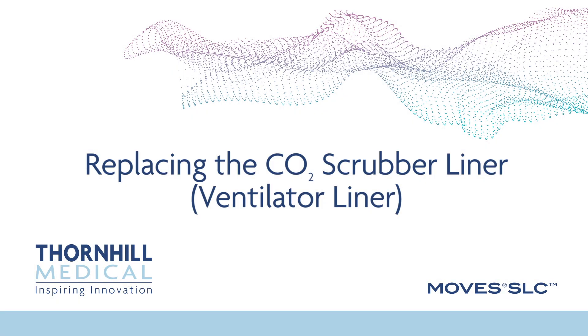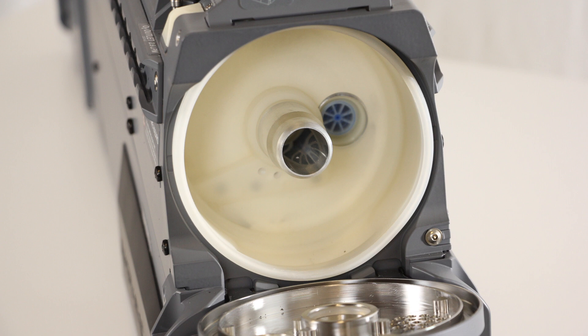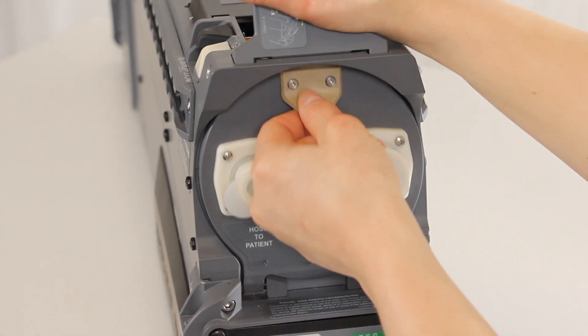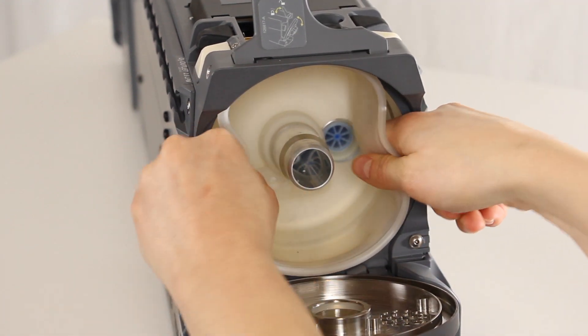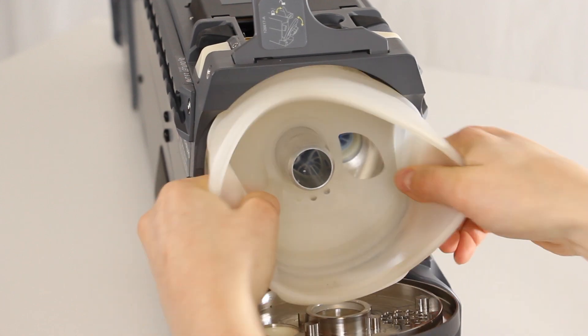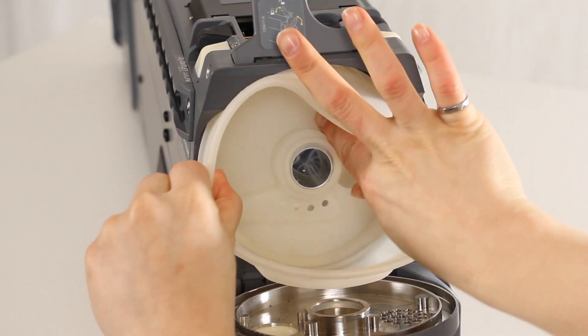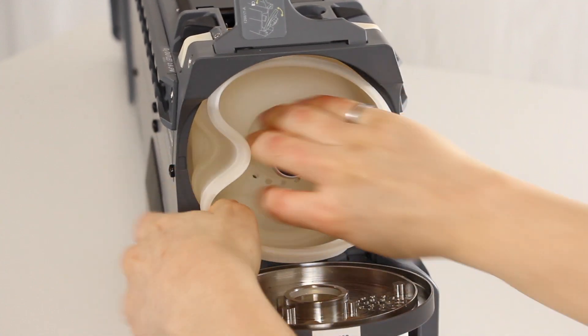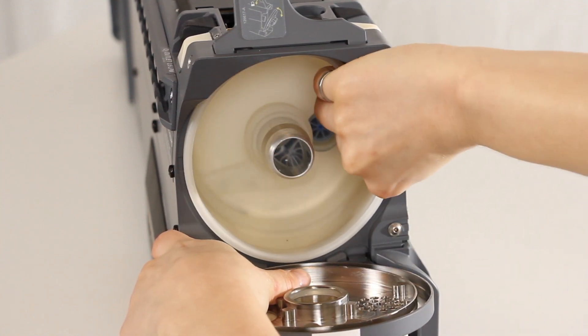Replacing the CO2 Scrubber Liner, also known as the ventilator liner. This is a user serviceable component that must be periodically replaced if it becomes damaged or compromised, or as indicated in the operator's manual. Open the ventilator cartridge door and locate the CO2 Scrubber Liner. Fold the liner in slightly and grasp the edges. Pull the liner forward until it is out of the cavity and discard it. Place the new liner on the middle tube, orienting it such that the water collecting cavity is at the bottom. Push the liner back until it is fully seated. Ensure that the inspiratory hole matches the corresponding liner hole.